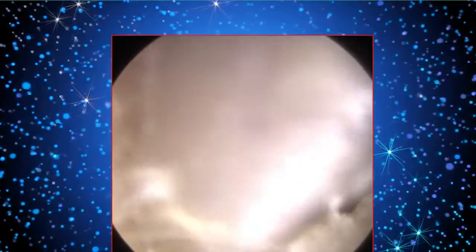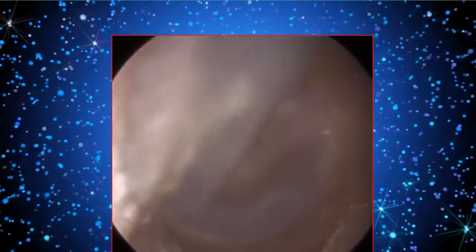In the case of this patient, I decided to remove it because the skin is not going to come out by itself. She has got a bit of otitis externa. You can see that's just scratching at the entrance just here on the right hand side. And that's because of the dry skin. So by peeling this dead skin, it's going to help the patient. So just gently lifting it off the base of the ear canal here.